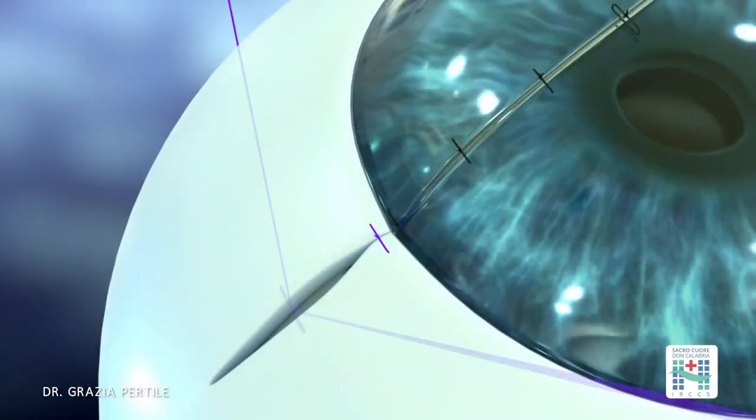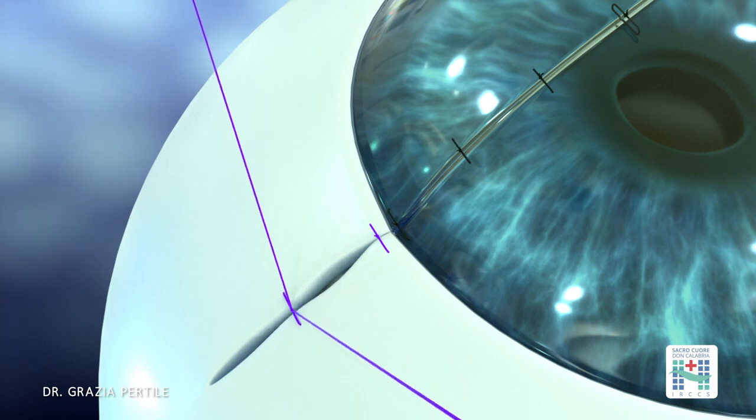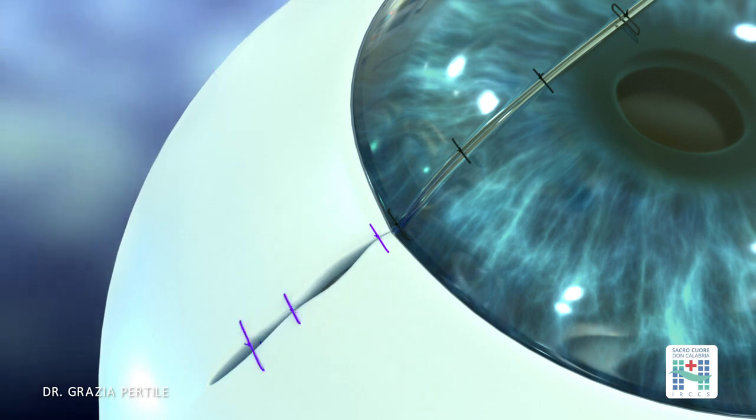Subsequently, the suturing of the scleral wound can be carried out. If the end of the wound cannot be identified, it may be necessary to disinsert the muscle for inspection.